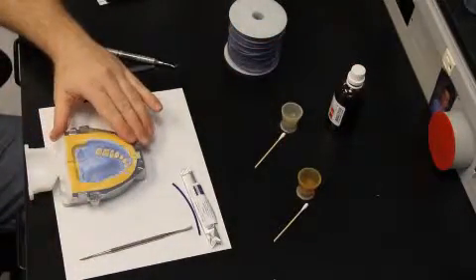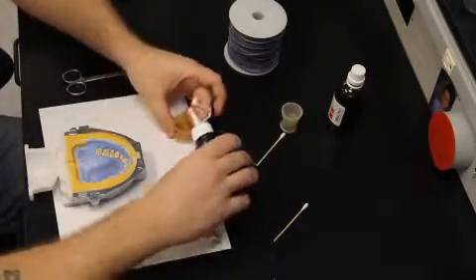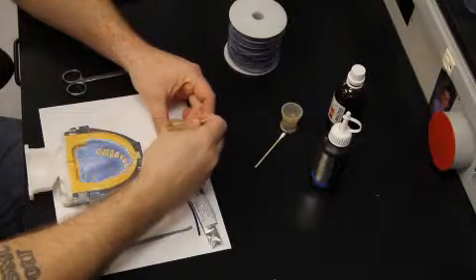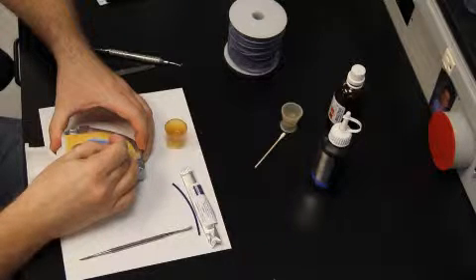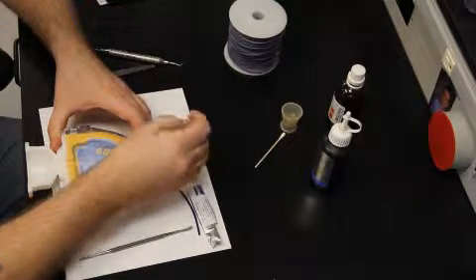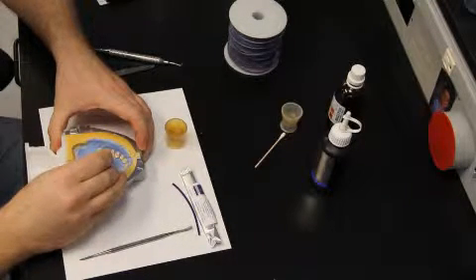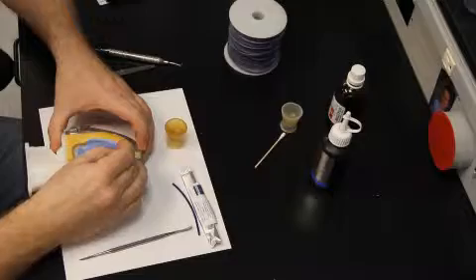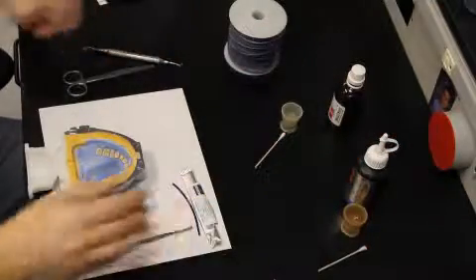Now with all dentures, you really do want to prepare the surface of the denture teeth. So the first thing I do is, after I give it a nice steam, separator's applied, I go ahead, take a little cold cure monomer, a little cotton tipped applicator, and go ahead, treat the surface of the teeth. Now you're going to want to hear that squeaky sound, squeaky clean as they call it, on all the teeth. Now the monomer is not really a bonding agent as much as it is cleaning the tooth surface off. So I go ahead and put that aside. Done with the monomer. Go ahead and give that a second to dry.